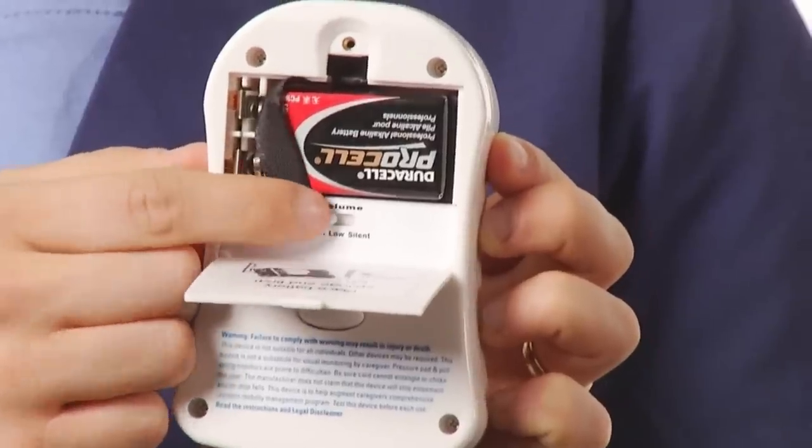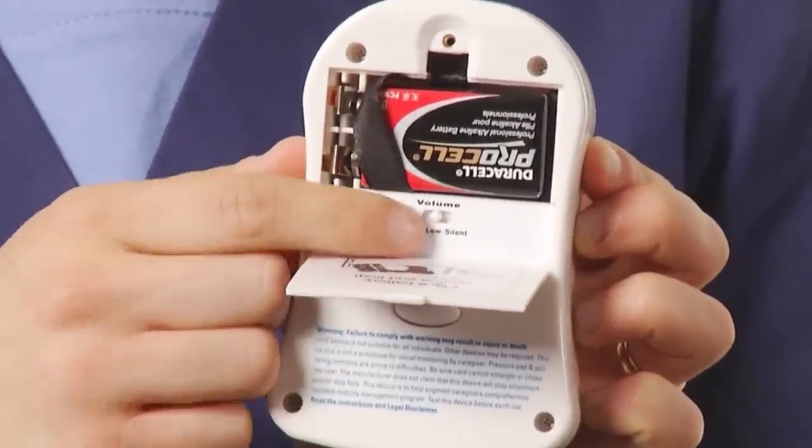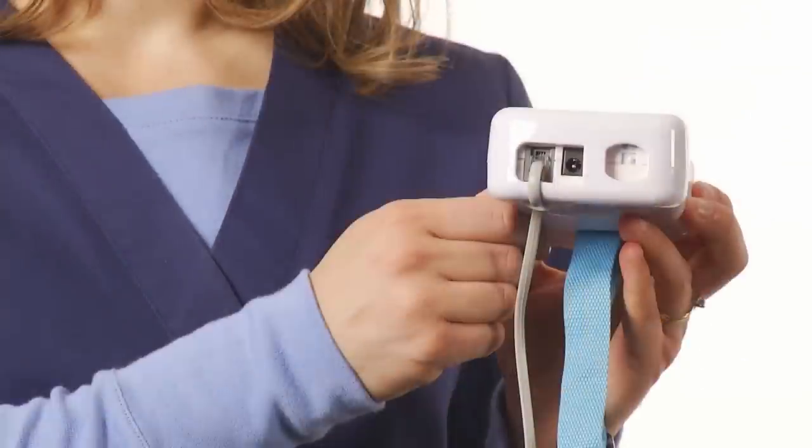Volume controls are also in the battery case, which can be screwed shut to prevent tampering with resident-specific settings. Be sure to set these functions according to your resident-specific care plan before putting the alarm into use. Weave the pad cord through holes in the protective boot and then into the pad jack on the bottom of the alarm.